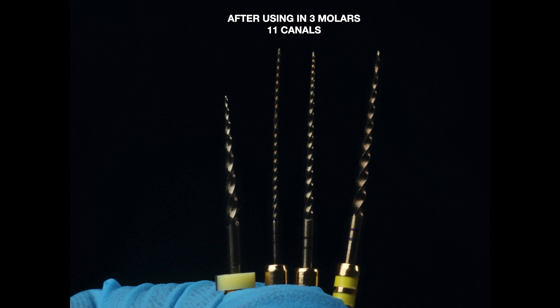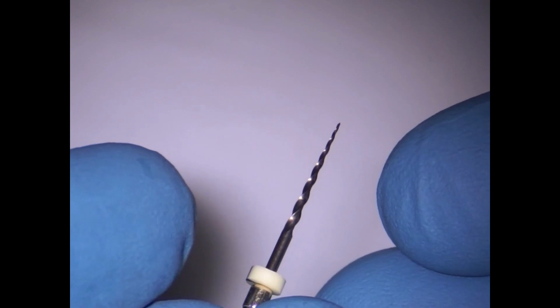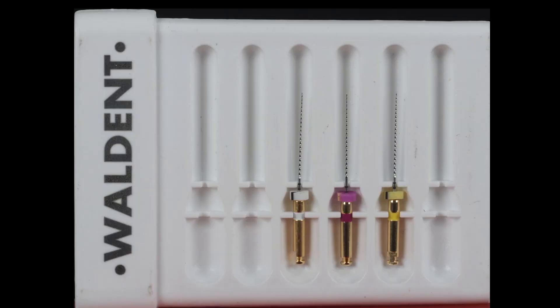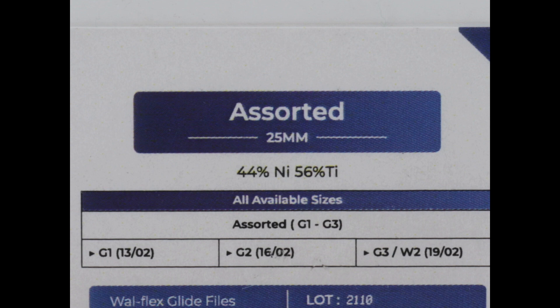I particularly like the orifice shaper because many orifice shapers have tips that are too thin and easily break, but this one had a good combination of flexibility and stiffness, making it easier to locate and penetrate canals just identified with the DG16. The best part is also the cost — this is pretty economical and friendly to the pocket. Additionally, rotary glide path files are available, though I am personally not a big fan of thin-tipped rotary glide path files as they are more prone to fracture due to torsional fatigue, but they are available for those who prefer them.